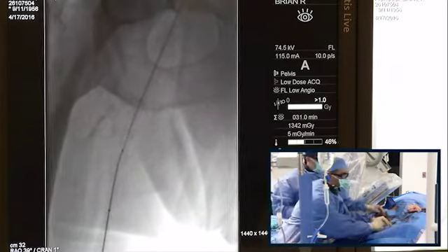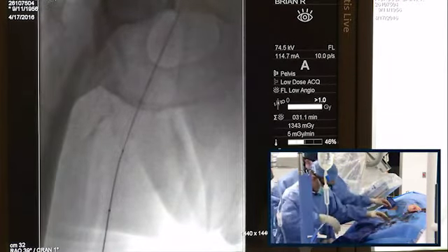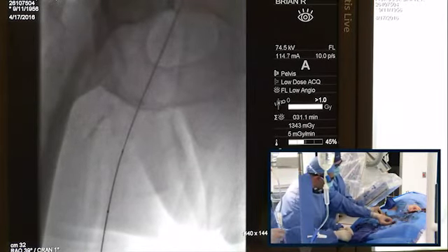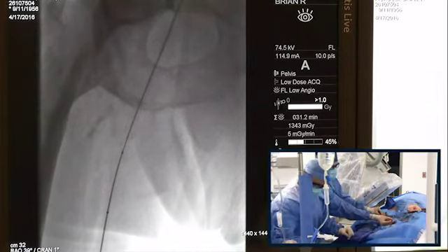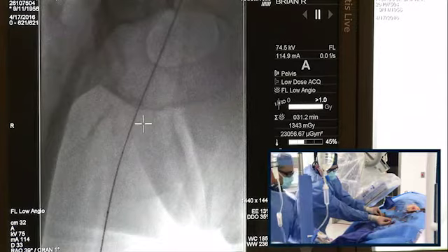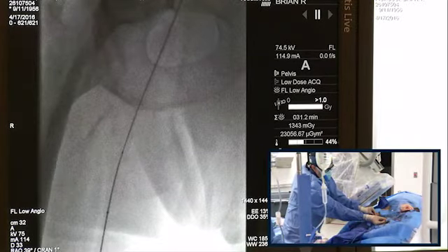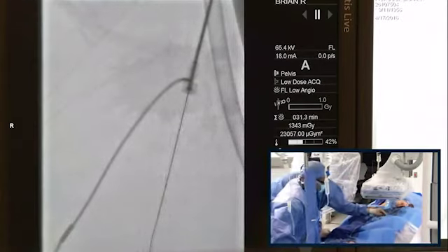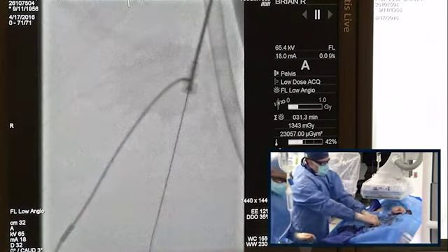Okay, put this wire back, please. Put this wire back. Put it on. Okay, so now we are able to extract. Can you show this area here? Let me pull this out. You have the wire here? Put it on. Okay, the wire is out, so we can take this out. So we externalize the wire. Now we can rail that.